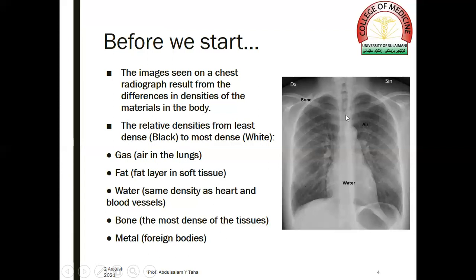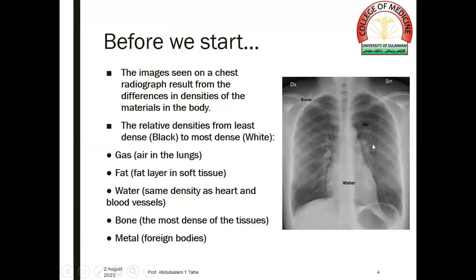If we look at this chest radiograph, we see that bones — in the form of the ribs, clavicles, scapulae, and vertebrae — are radiopaque. The mediastinum, in the form of the heart and central mediastinum, is also radiopaque but less so than bone. While the lung parenchyma looks radiolucent because it is filled with air.